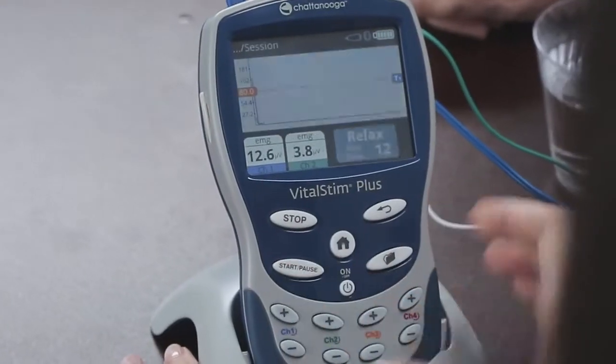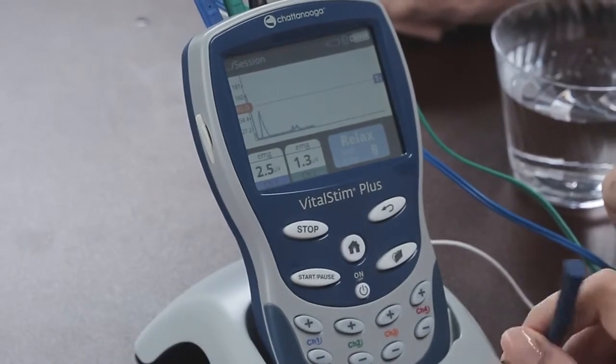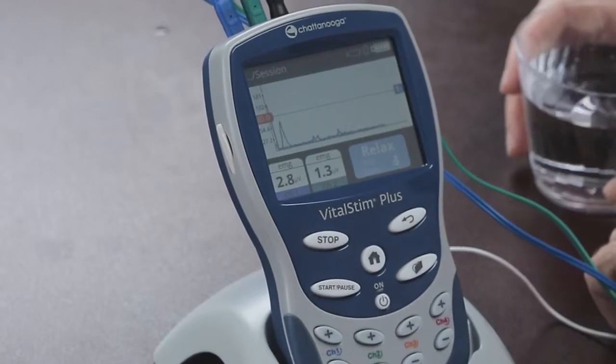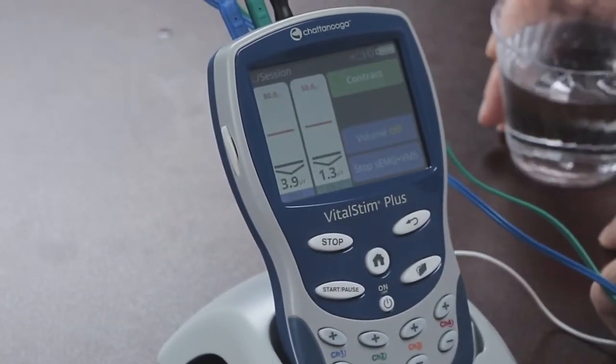And once we are at the right level, press Start, Pause, and the machine will start in relax mode. In relax mode, the instructions will be provided to the patient to say, okay, get ready. You're going to be asked to swallow. When you get the swallow going, try and put in a big effort to reach the threshold.